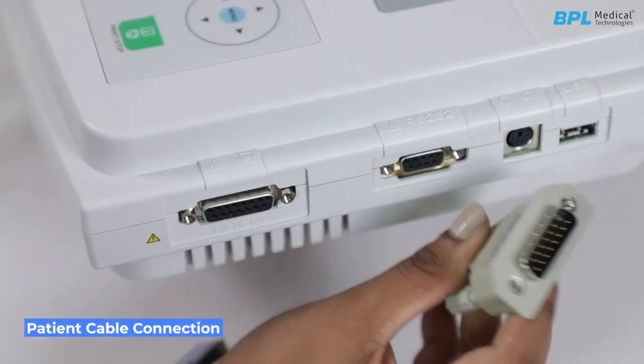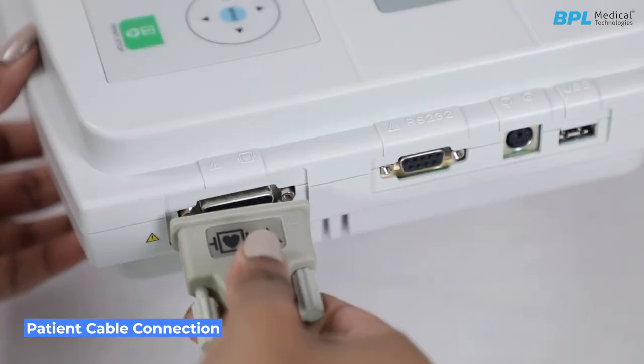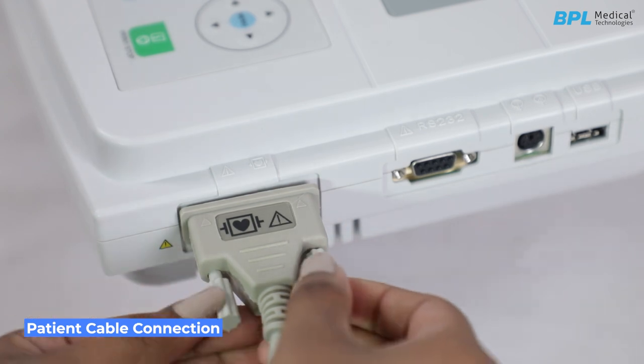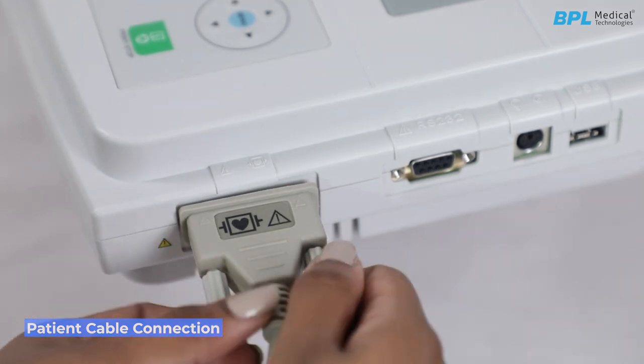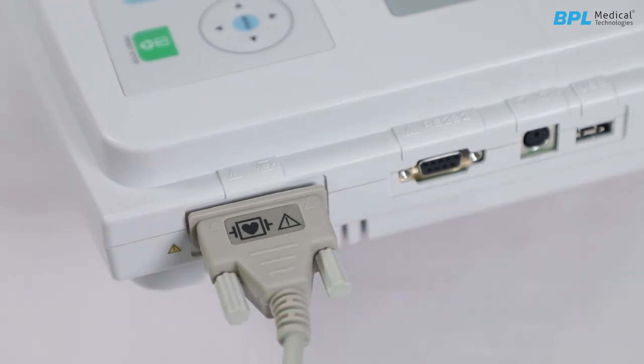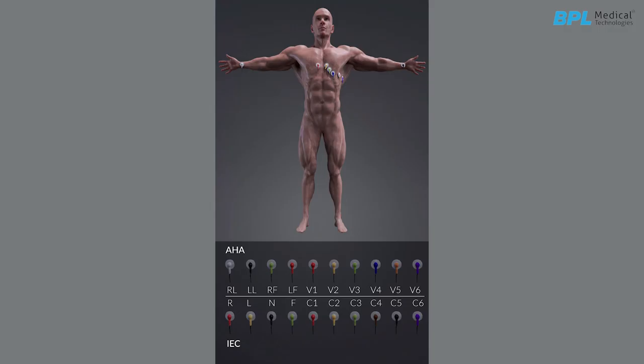Patient cable connection. Connect the patient cable to the connector and secure with the two screws. Align all lead wires of the patient cable to avoid twisting and connect the lead wires to the reusable electrodes. The identifiers and color codes of the electrode connectors comply with IEC standards.